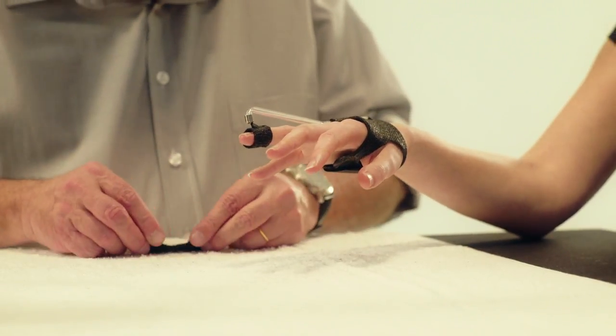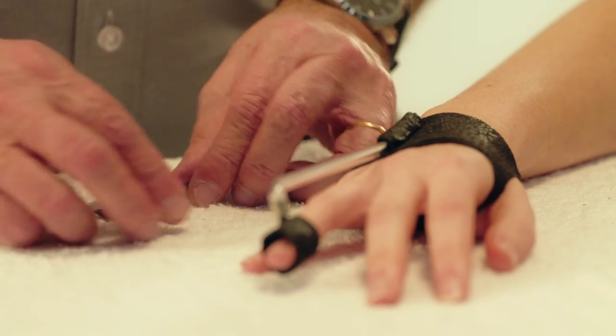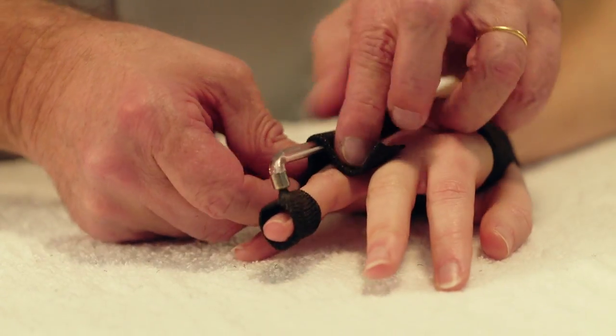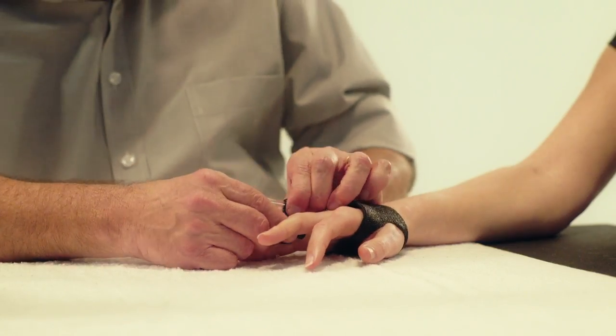Take a piece of OrphiCast and heat it. While the patient wears his or her orthosis, fold the OrphiCast over the Orphi tube at the height of the first phalanx.